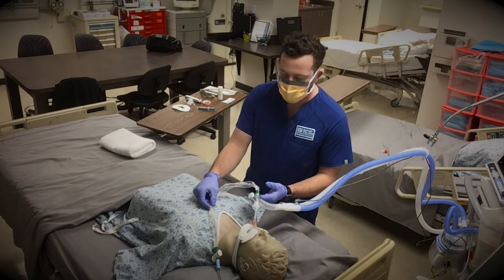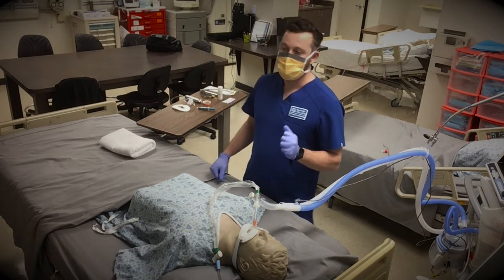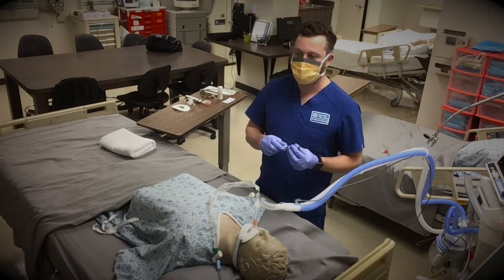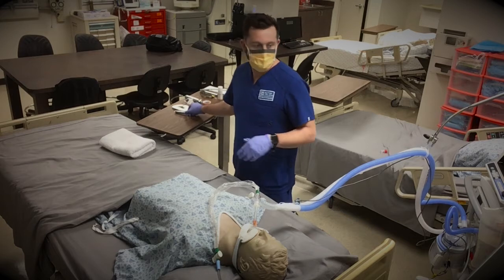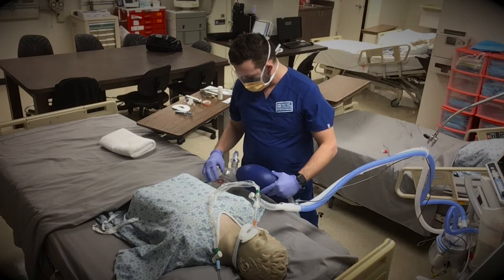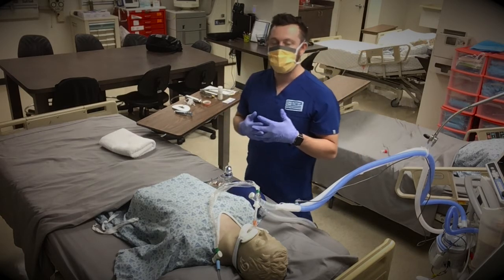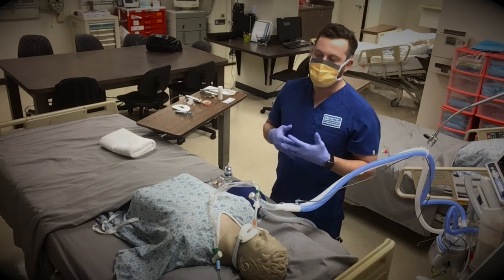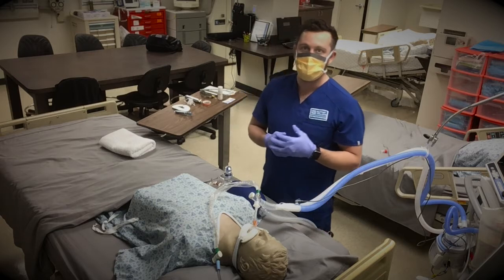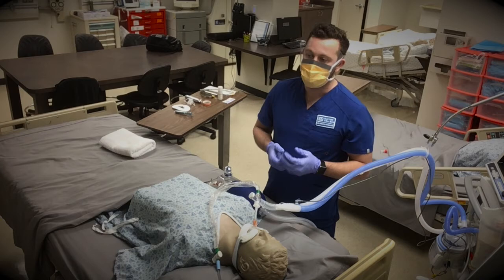We have a Ballard that is currently hooked to the patient. We need a 10 ml or 12 ml syringe, a manual resuscitator with the appropriate sized mask, and, if ordered, keep on standby just in case racemic epi and normal saline in case the patient develops any post-extubation stridor from removing the tube.